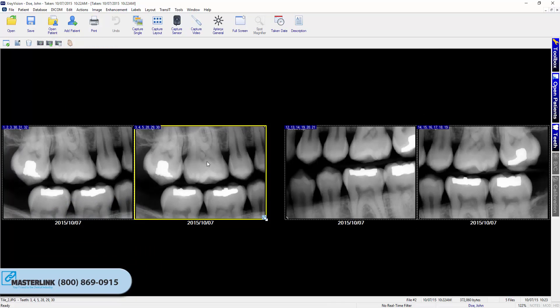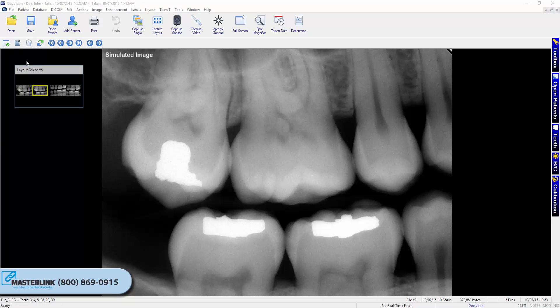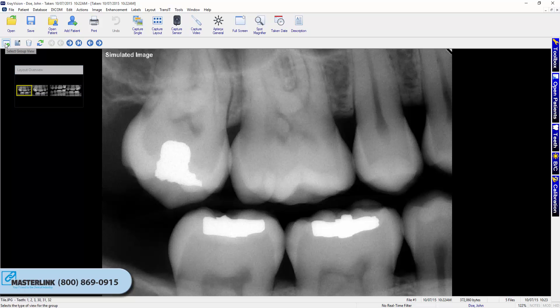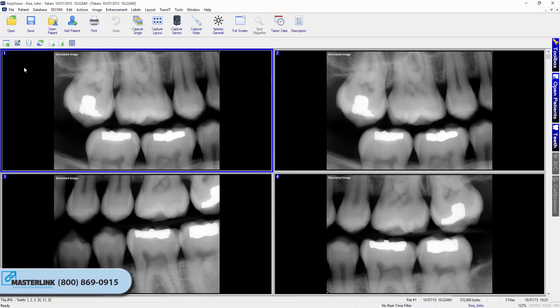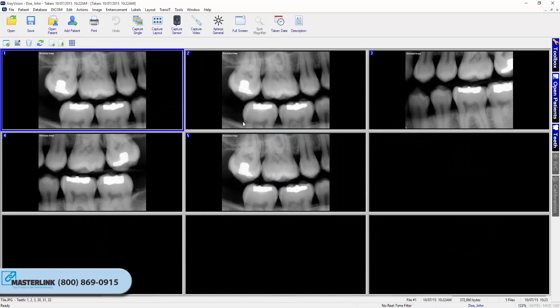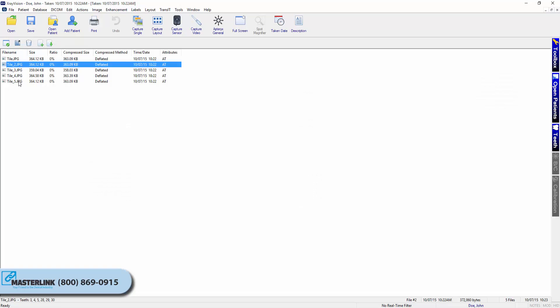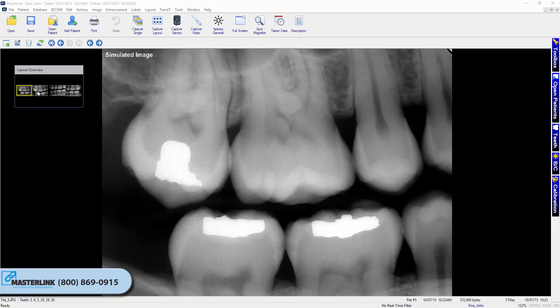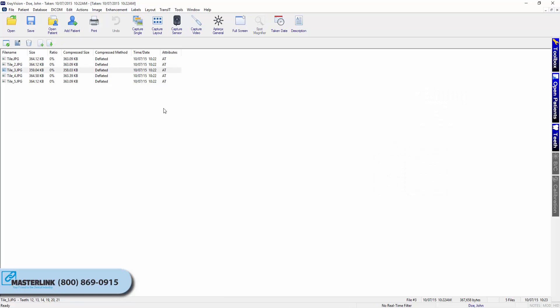The blue and white arrow buttons can be utilized to cycle through layout images. Double clicking on the single image will zoom out and return to the full layout view. The Single Image View option will zoom into the selected image, and the layout overview window shows a small representation of the layout — clicking on the tiles within this window will change the single image view to the selected image. Grid view displays all the images in a grid format, with the option to change grid size. List view provides the user with the file list of images in a layout; double clicking a file opens it in single image view, and double clicking the single image returns the user to the file list.